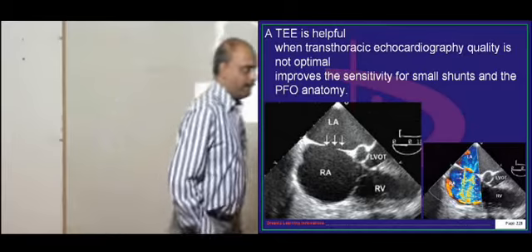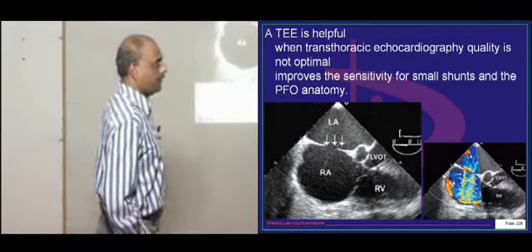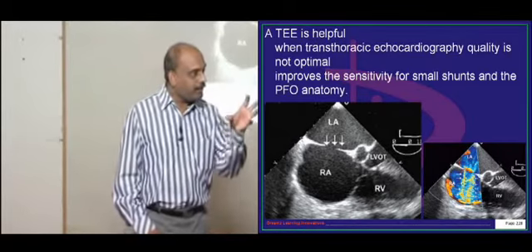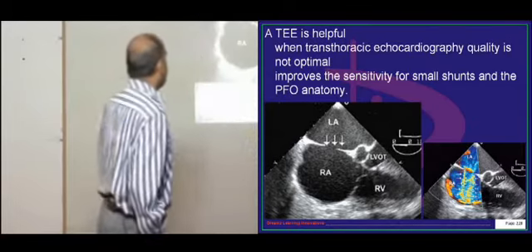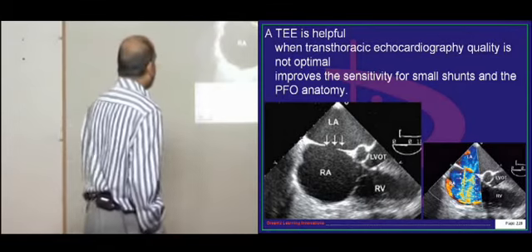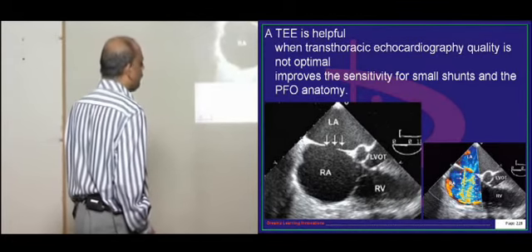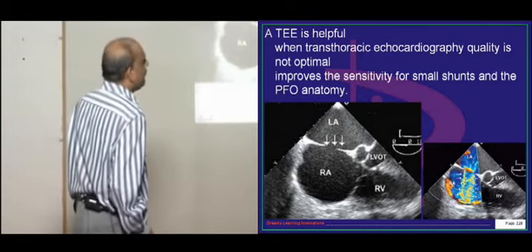Transesophageal echocardiogram, does it have any role in identifying the ASD, is a very important question. Sometimes transthoracic may not be optimum, there you can basically use it, but generally transesophageal echo is more wonderful for imaging the left atrium because it is a more posteriorly located chamber. So this is a typical transesophageal echocardiographic view where you can see the left atrium, right atrium, and this is the LVOT, left ventricular outflow tract, which is originating basically from the left ventricle, and right atrium draining into the right ventricle. So you can see the flow pattern which is happening between the two.